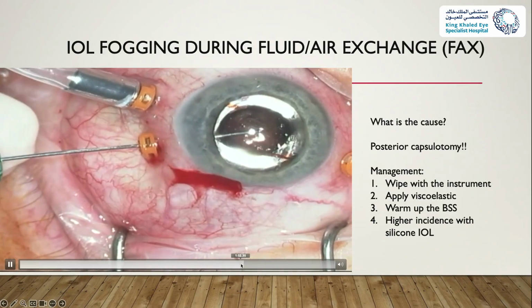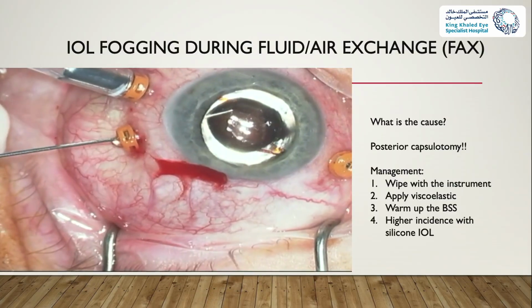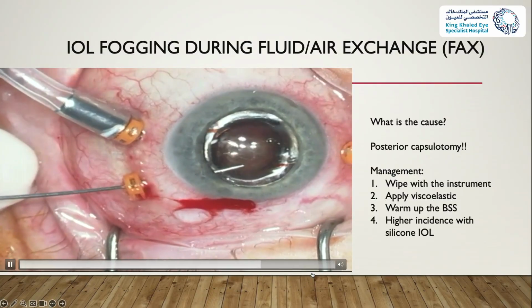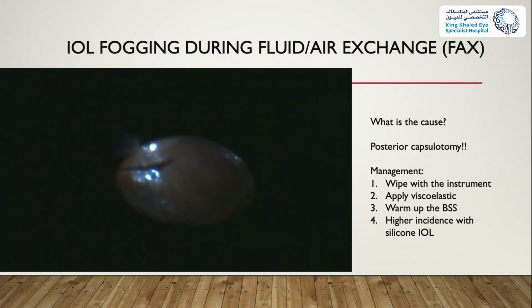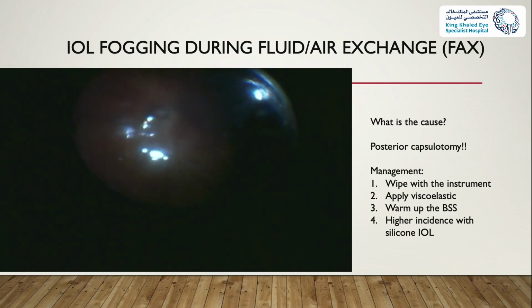Yeah, so you can inject viscoelastic to the back, and that will create a nice clear interface, and then you can carry on doing the surgery, so the view is a lot better, and you can then do your surgery without the difficulties.